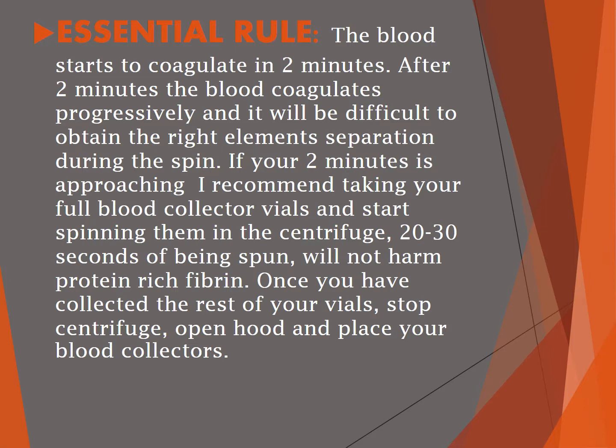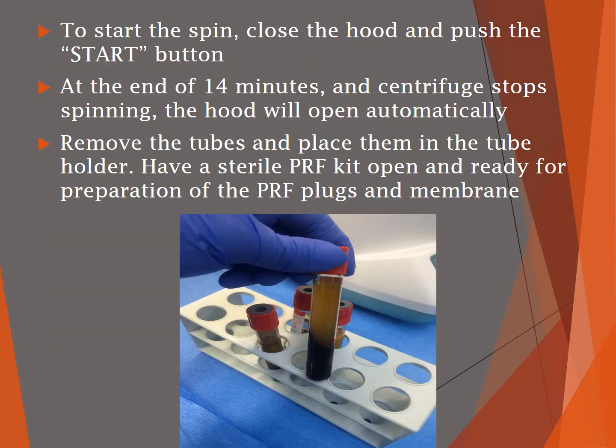Once you've finished collecting the rest of your blood vials, stop the centrifuge, open the hood, and place your blood tubes inside. To start the spin, simply close the hood and push the start button. At the end of the fourteen minutes, the centrifuge will stop spinning and the hood will open automatically. Remove your tubes and place them in the tube holder.